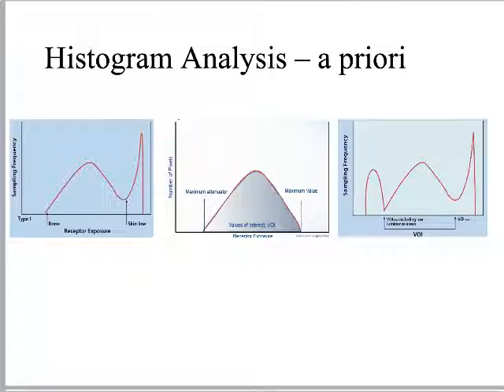On this illustration here, I like this picture particularly on the far right, because now we have a histogram that looks really funny, right? So in this example, on the far left, I've got a funny little bell-shaped curve.